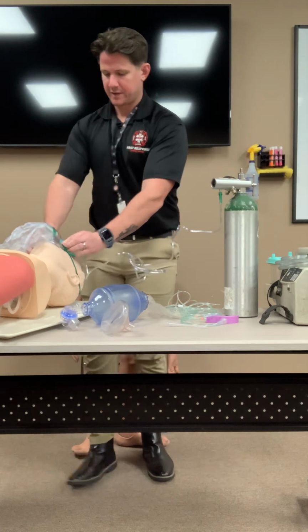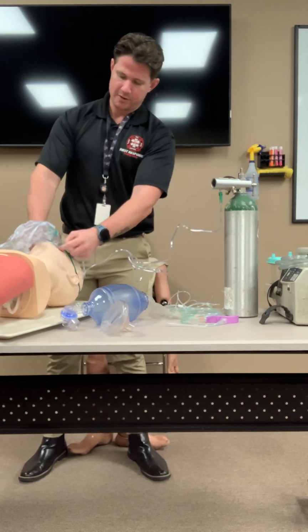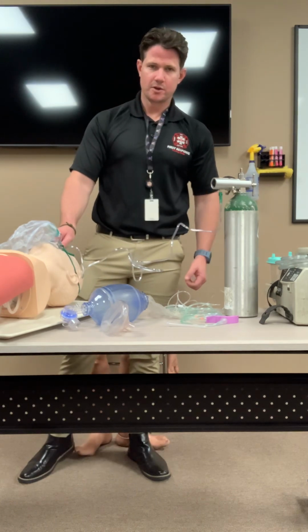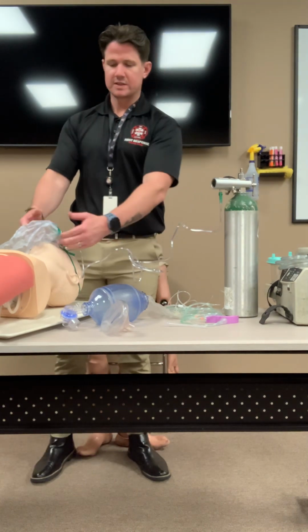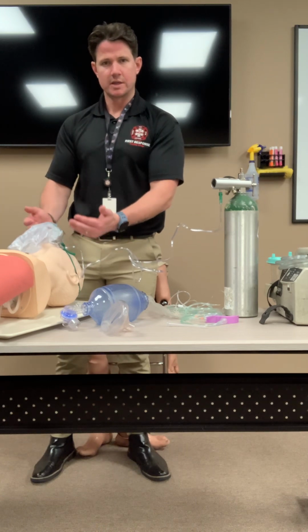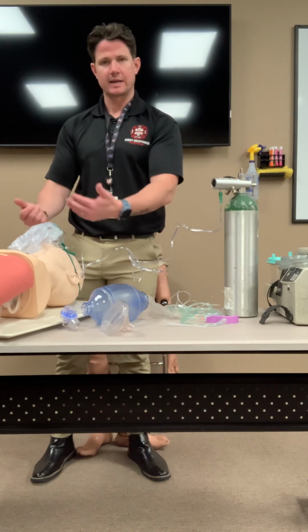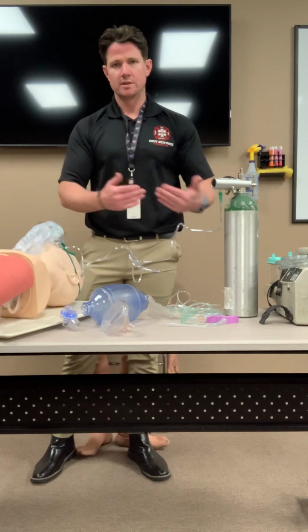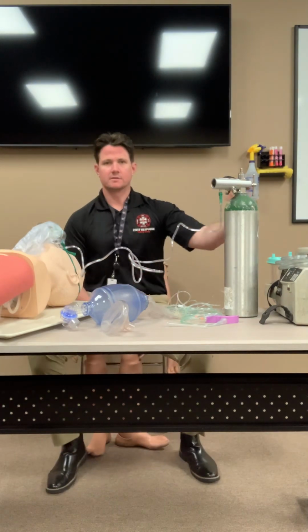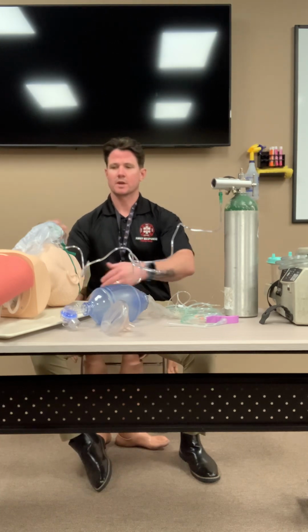All right, and the key here is once you have the non-rebreather over the bridge of the nose, you're going to want to pinch the nose crimp, right? Once that's on, verbalize that you check for an adequate seal and you do not have any leaks. At that time, you'll be prompted to discontinue the oxygen via the non-rebreather and disassemble the oxygen tank, okay?